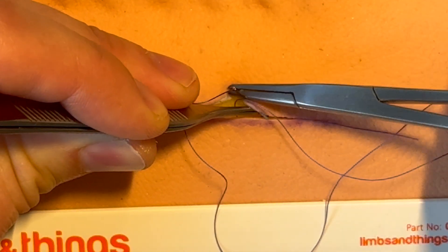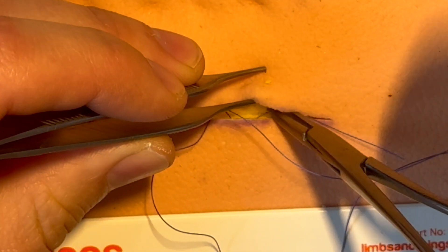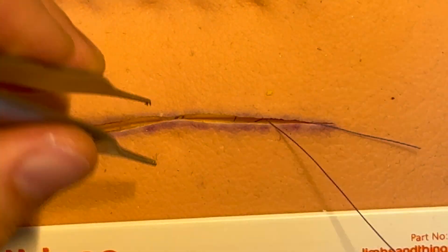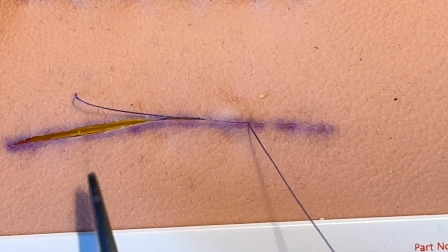Pull it through and tie the knot again — pull it nice and tight. We can see here we're getting a much better dimple because it was a bit easier to handle the suture.